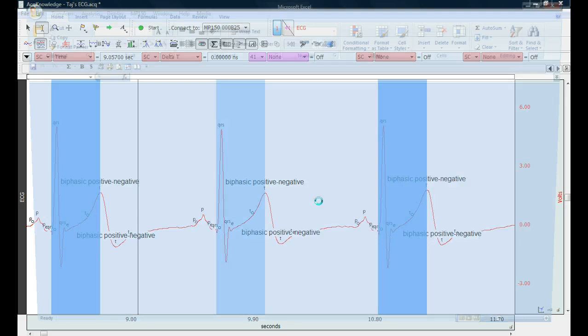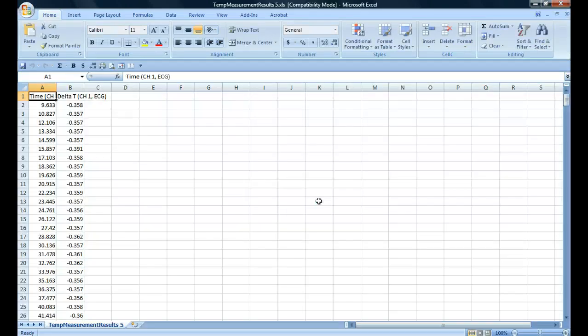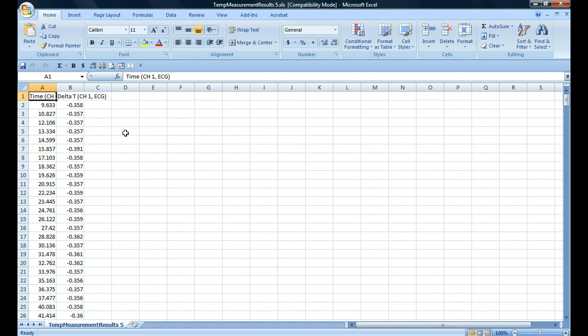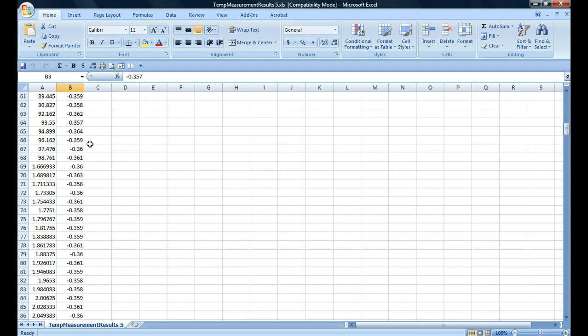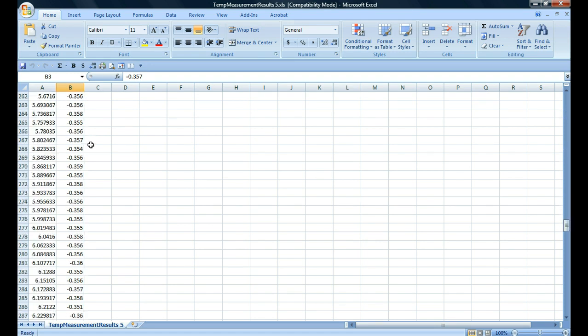It will open up Excel and it will dump in all of those measurements, time and delta time for every ECG cycle in the file. So here's our time, here's our Qt interval, here's our time, here's our Qt interval, so here's all the data here. And that's how we extract Qt intervals from ECG data.